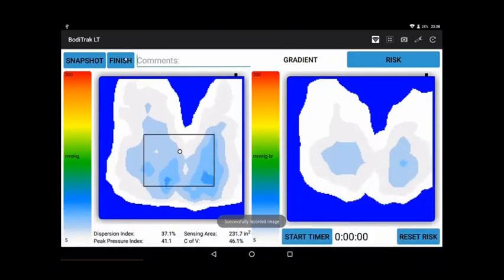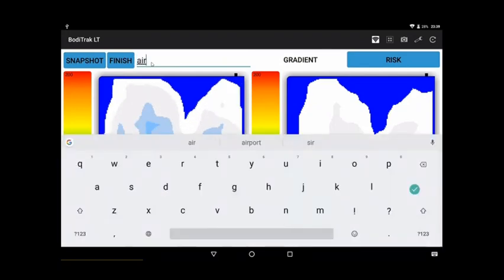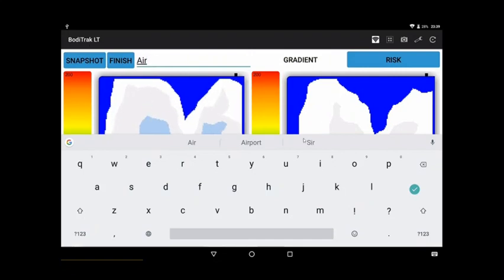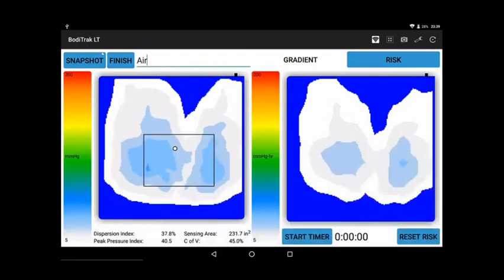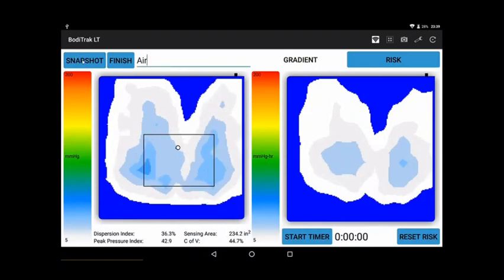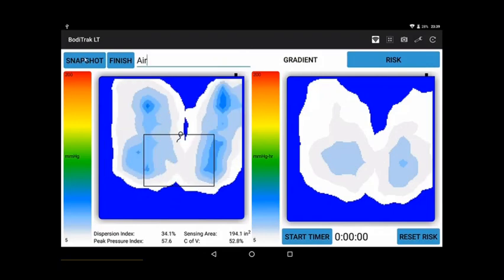Perhaps last we're going to try an air cushion, which is a popular choice. The idea is to kind of bracket the possible solutions. Hopefully if they really need an air cushion, you can demonstrate that giving them a foam one is not going to be a very good solution.